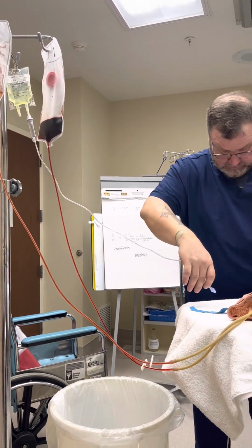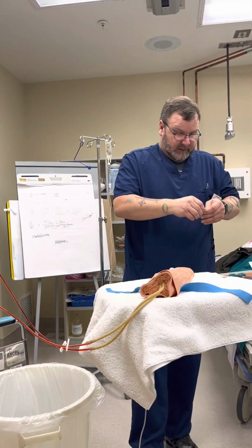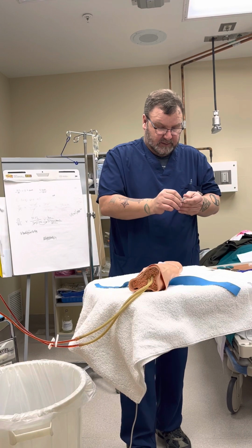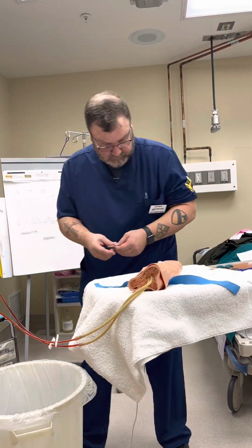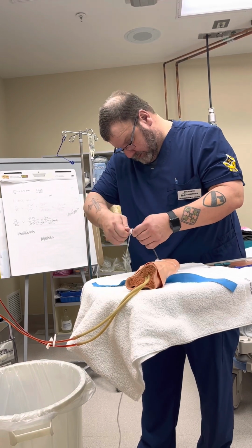And we've got that going for us, hanging. Take another alcohol swab and clean off my port.